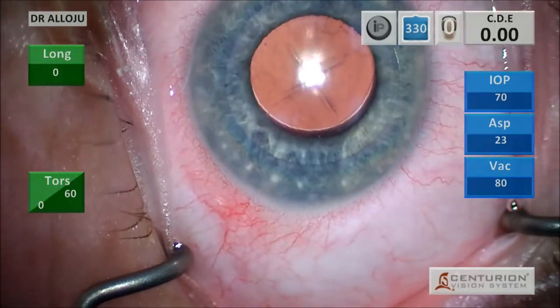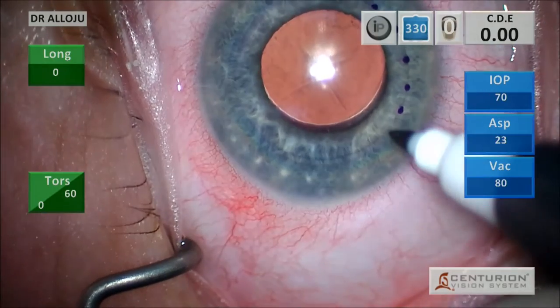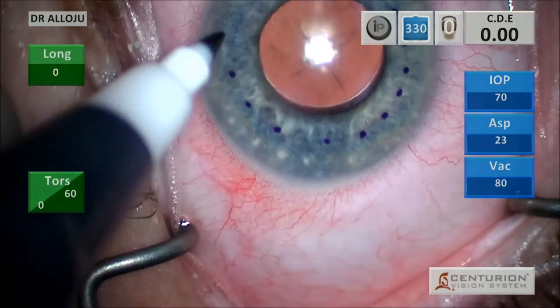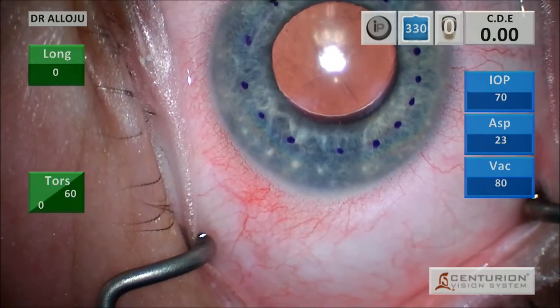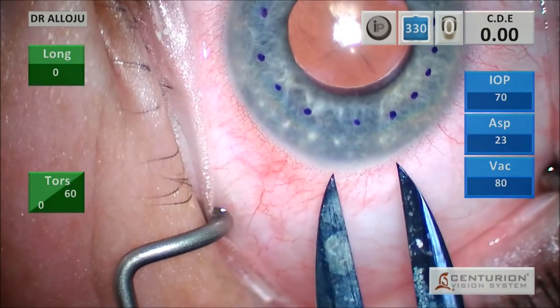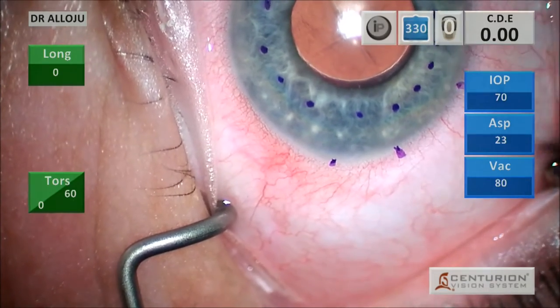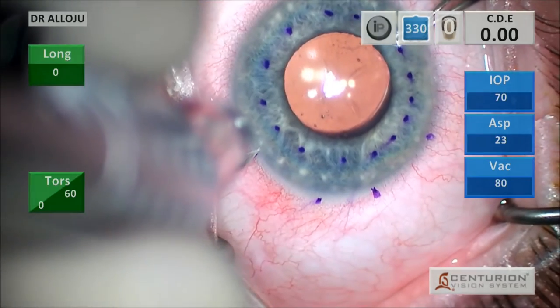Here I'm using an 8 mm ring marker. And we mark this because this is the site that we're going to have our descemetorhexis. I currently use a 3 mm wound, and that's what that caliper is set at. And the other two marks there are for my side port.